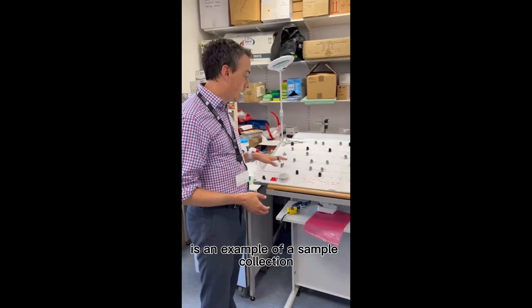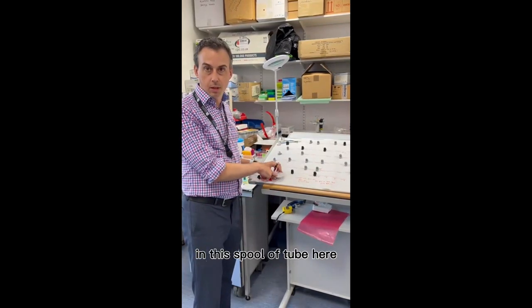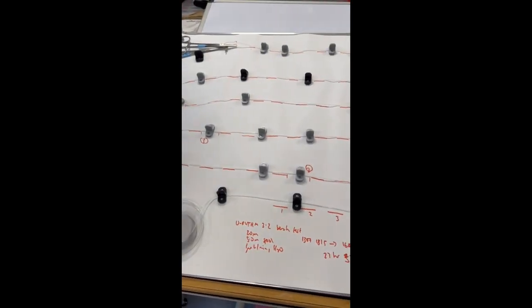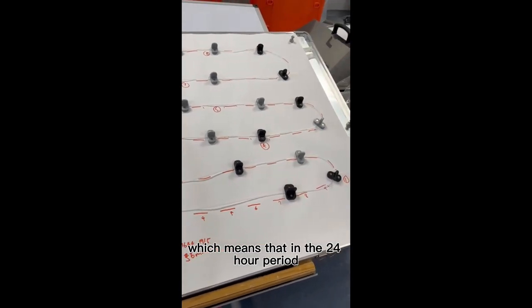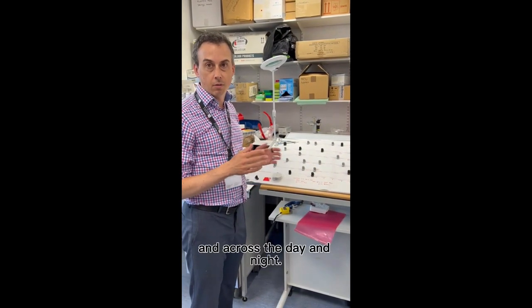What we've got here is an example of a sample collection that we might have collected from one of our participants. All the samples are collected in this tube here, and then they're separated out into individual samples all the way along — I've numbered some of them there, as you can see. We've got 72 samples altogether, which means that in the 24-hour period, we get a really high-resolution profile of what's happening with the hormones hour to hour and across the day and night.